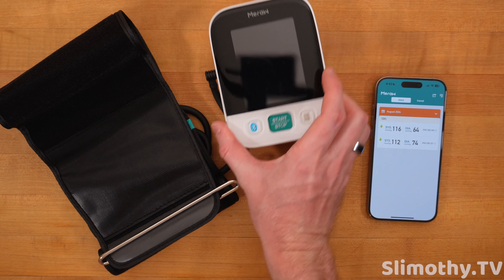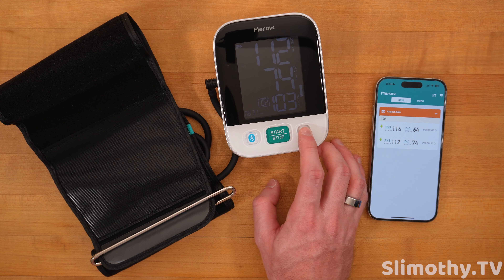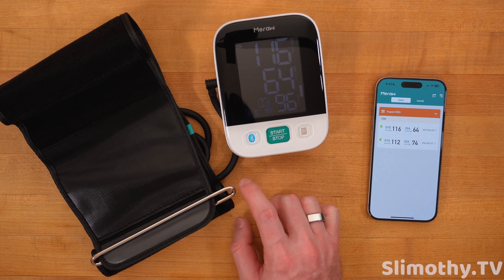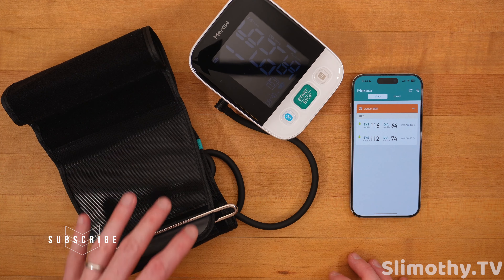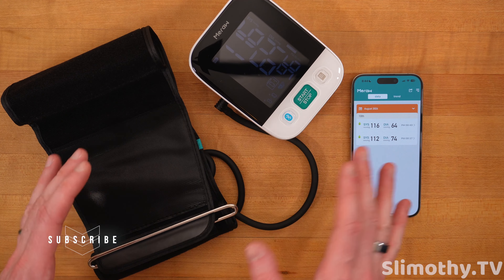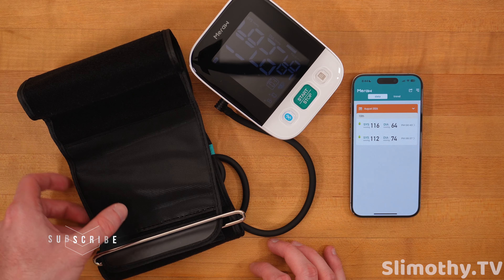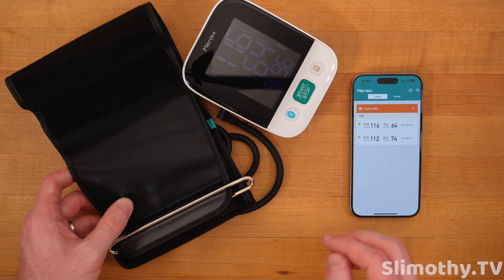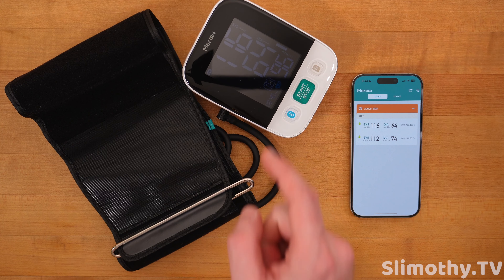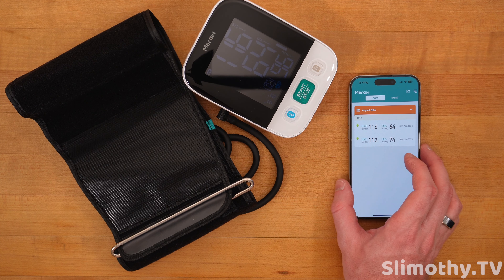It does feel super solid. Clicking the menu button, you've got Memory 1 and Memory 2, so you can review readings right on the unit without needing your phone. Coming into this review, I was expecting setup to be much more complicated, but it's been super easy. If you're looking for an at-home blood pressure monitor, this might be worth checking out — link is down below. They've got different colors too.